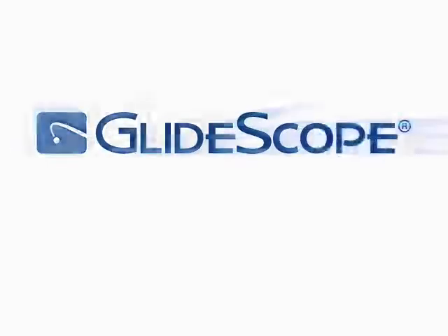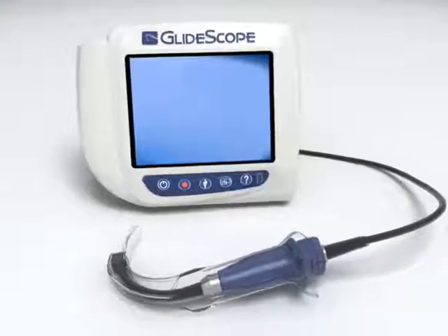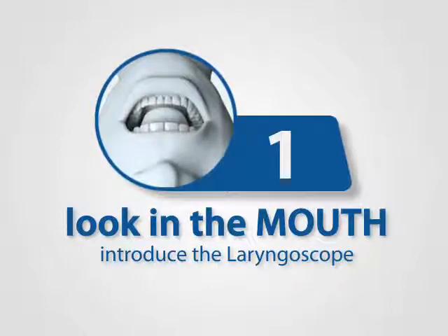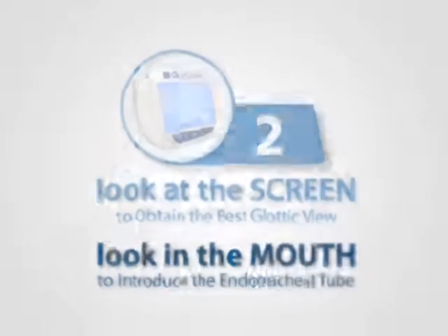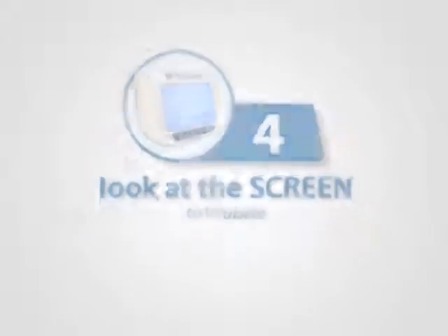The GlideScope Video Laryngoscope, designed for first-pass success. A four-step technique to GlideScope video laryngoscopy combines direct vision of the patient with views on the GlideScope video monitor. Start by looking in the mouth to introduce the laryngoscope, at the screen to obtain the best glottic view, back in the mouth to introduce the endotracheal tube, and finally, at the screen to intubate.